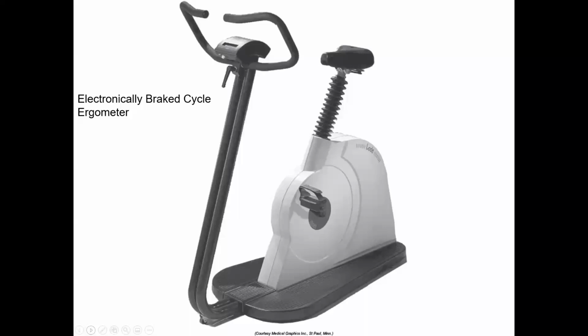Ergometer, nothing fancy here, but just get an idea. It needs to have the ability to be adjusted per the desired protocol that's actually used. The protocol would be when you're increasing the stress or the exercise load, it needs to be done in a precise manner per protocol. Okay, so one of the protocols, for example, is what's called the Bruce protocol.